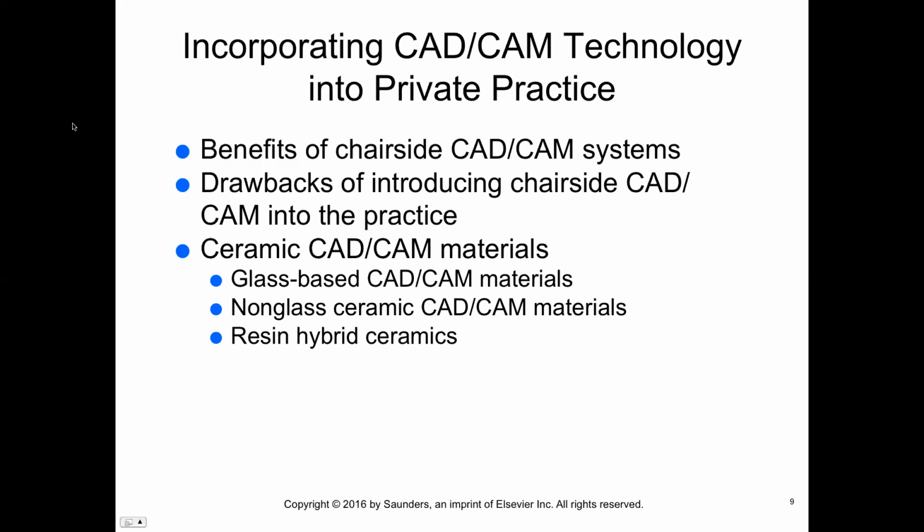Benefits include being able to view a three-dimensional image of the tooth preparation on the computer monitor from several different angles. The dentist can then modify the preparation as needed before processing the restoration so that potential errors can be eliminated. Also, the impression procedure is simplified because no cord packing or impression material is needed. So this is just some of the benefits of the CAD/CAM technology. Some drawbacks include the initial expense of the system, a significant learning curve, and custom staining requirements.